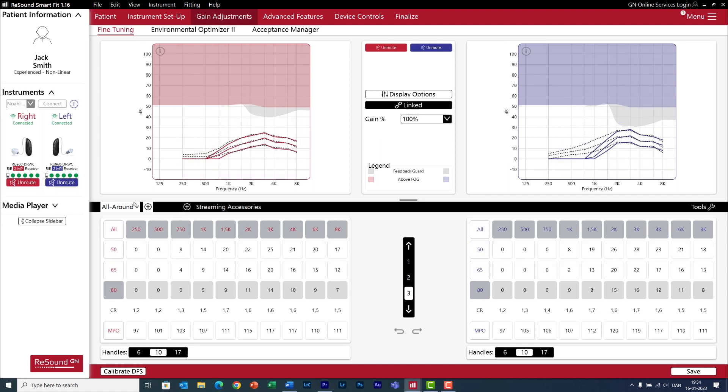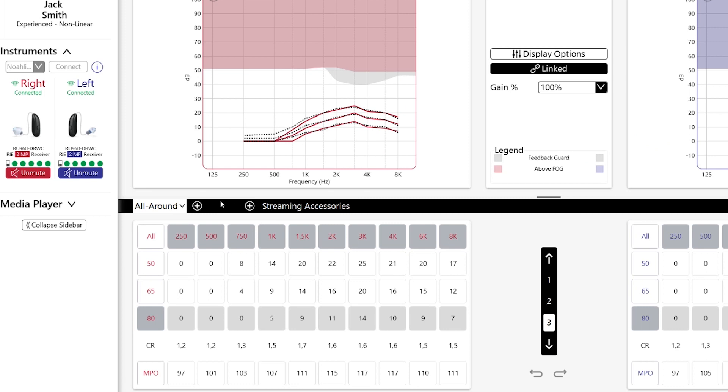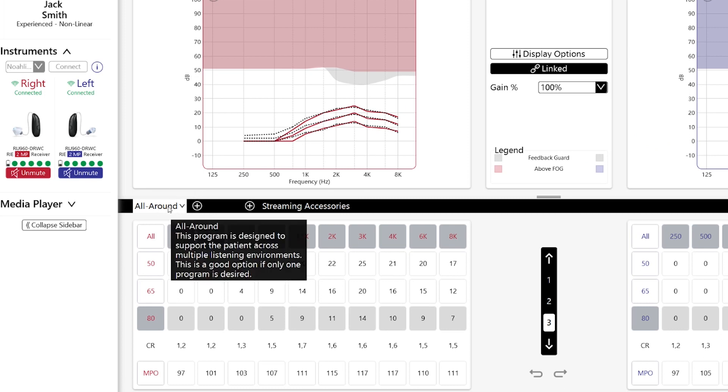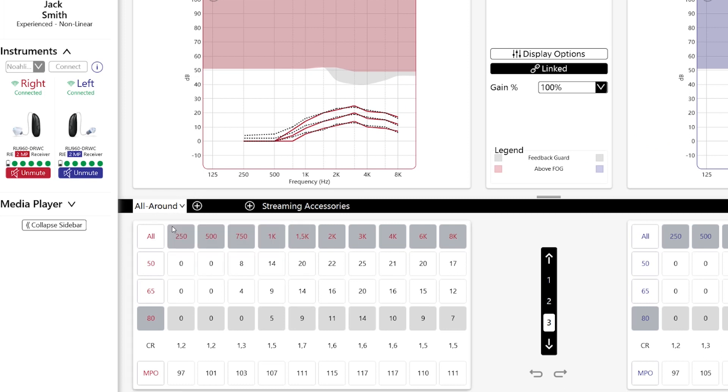And here you can select if you want to do adjustments in steps of one, two or three decibels, up or down. In the middle, we have the number of programs in the hearing aid.